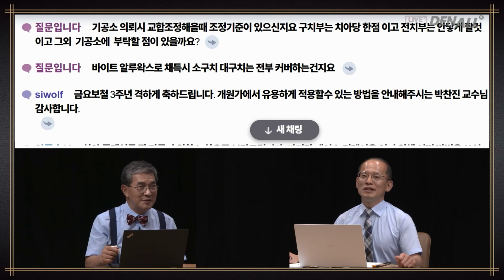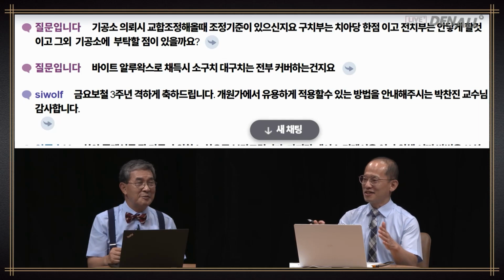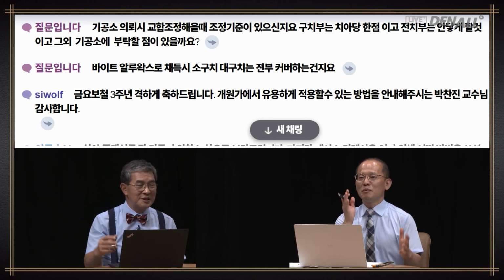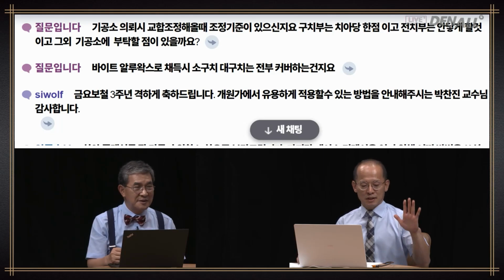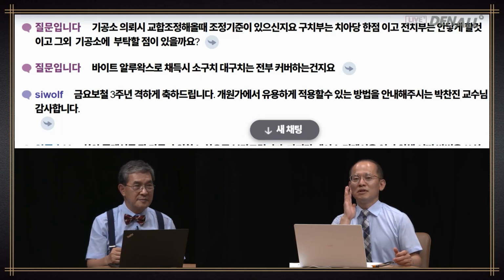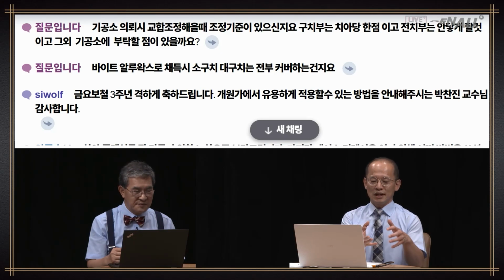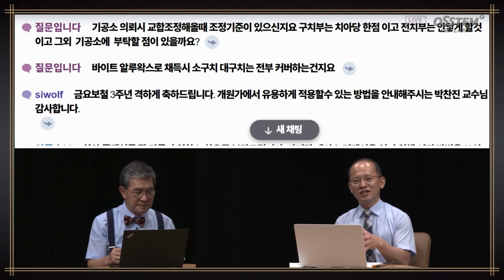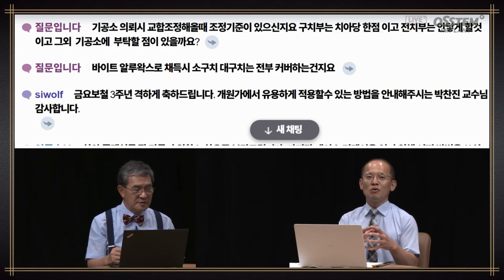Well, he has very good questions, and it's like a hidden hand guiding us in a certain direction because he's really asking core things. Let me talk about how I approach it. Basically, I don't believe the impression that I take. The bite that I take, I always check and check again to see what is accurate for the patient. Even when I did clinical remounting, it's always different.